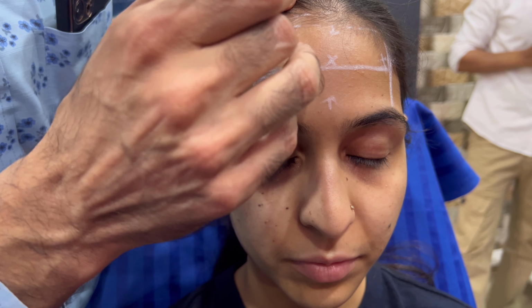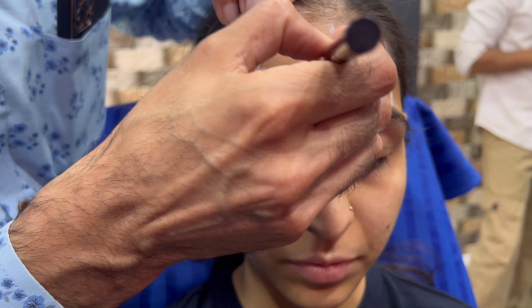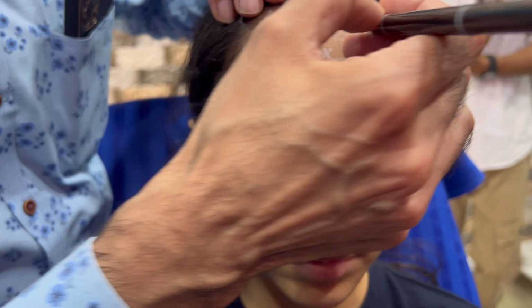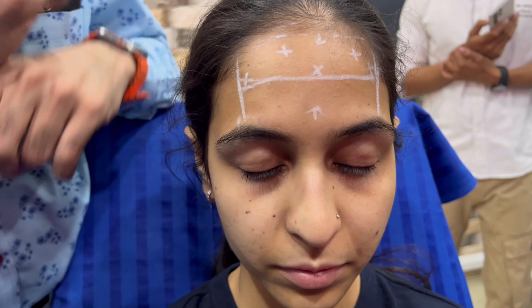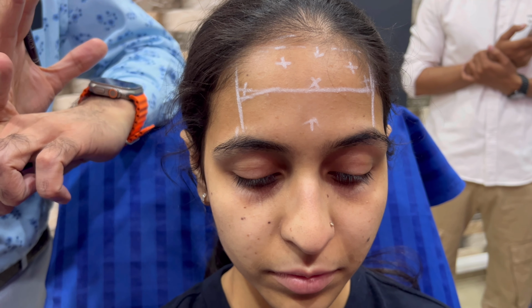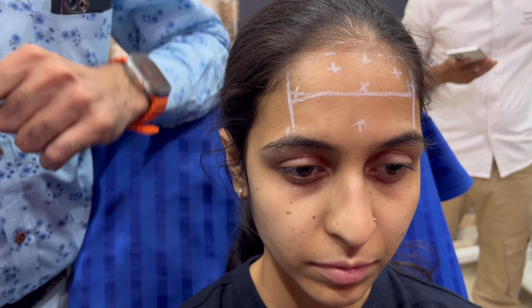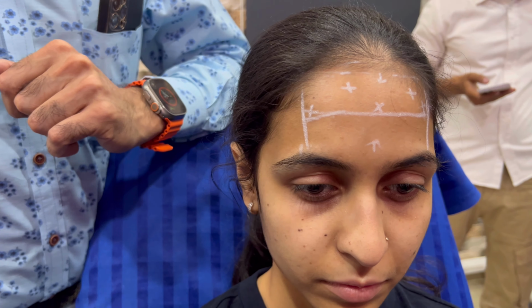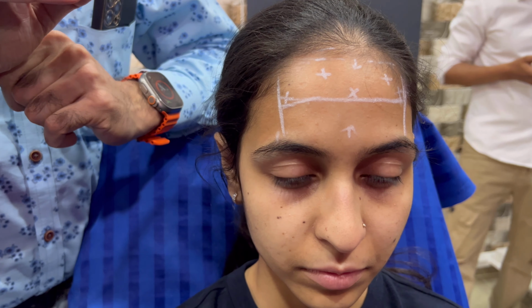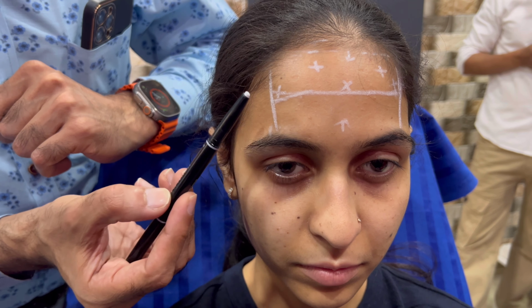And from the hairline I go 1 centimeter lower and I mark a point in between these 2 points, here and here. Clear? The lateral point. Now for a male client, they don't like the peak to arch, but a female wants it arched. So for my female patient, the needle is being turned inside because I don't want to touch.